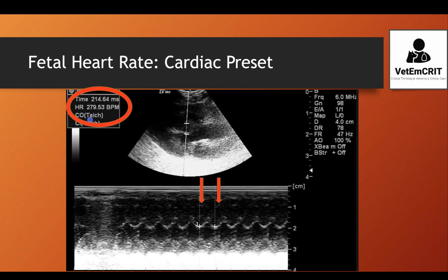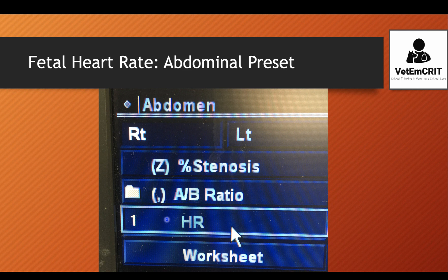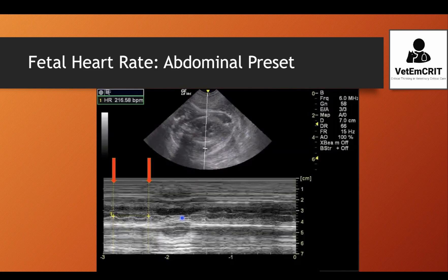In this case, the result was 279 beats per minute, which would be extremely hard to obtain with just subjective counting by looking at the beating heart. Next, we'll briefly cover how to get the same measurement using the abdominal preset. The principle is exactly the same: you choose your abdominal preset. You won't have the LBRV study option available, but the majority of machines will have an option called HR or heart rate. You click on it, identify the fetal heart, choose M-mode, and put the M-mode cursor across the heart in a similar way as demonstrated previously.